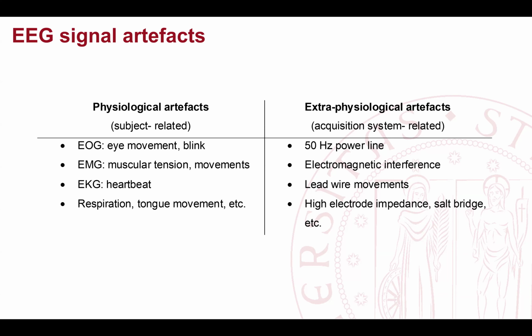But the problem is that what you are recording on the EEG is a transformed version of the original one, so it's not that easy to do a template matching as in other scenarios. And most of the time, these techniques would not work in real time, and so it would make the process so slow that it would be useless to use the EEG in real time.